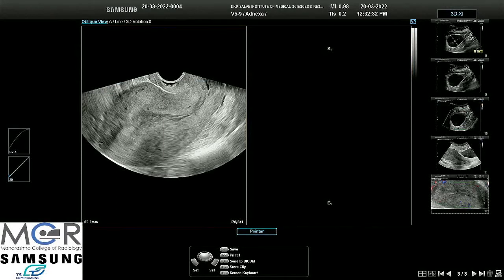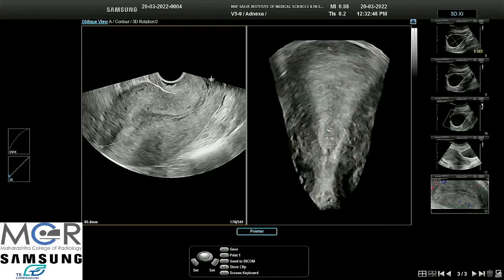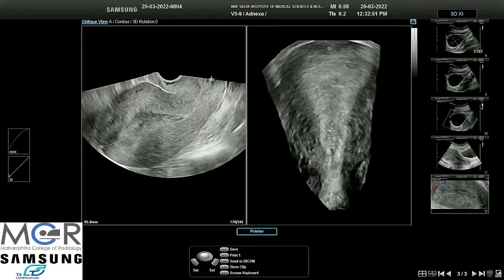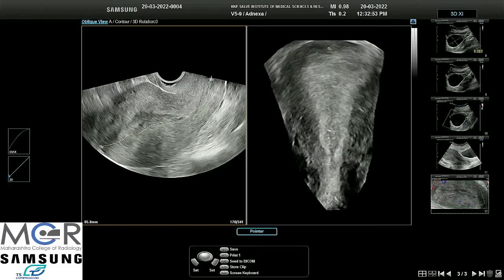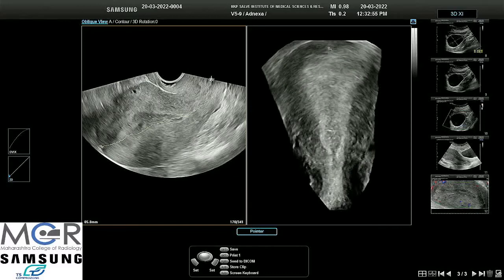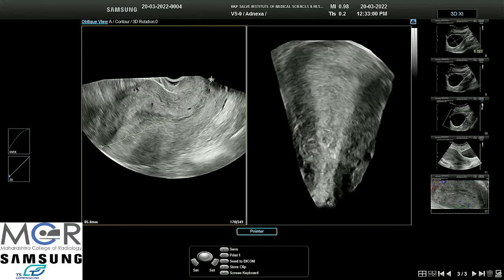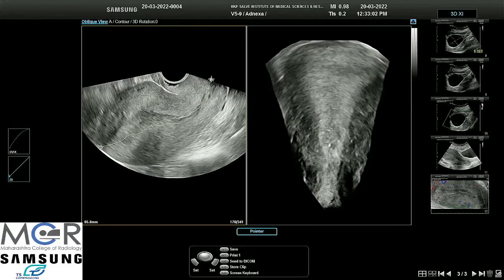Dr. Saw is taking the 4D. I am just highlighting the points — the endo-myometrial interface is not clearly visualized, that is lost. We can see some glands protruding inside, and besides there is irregularity in the endometrial lining.